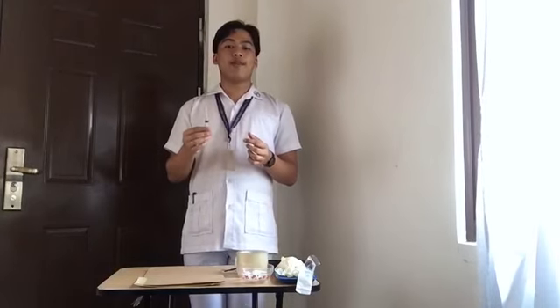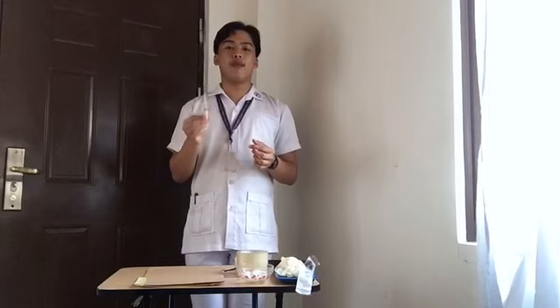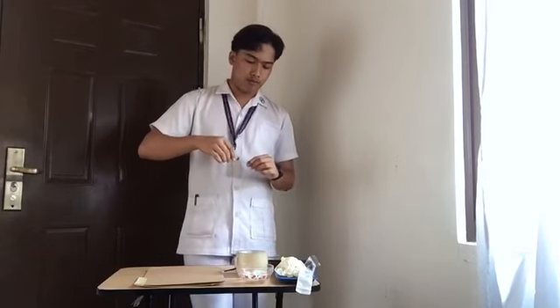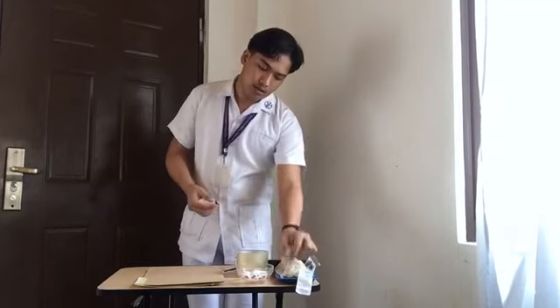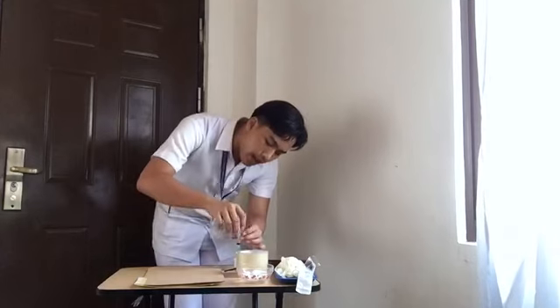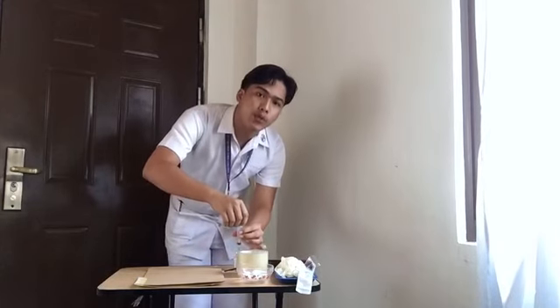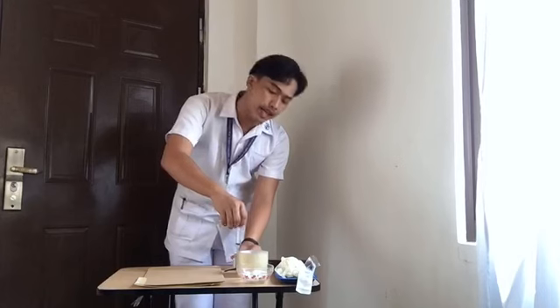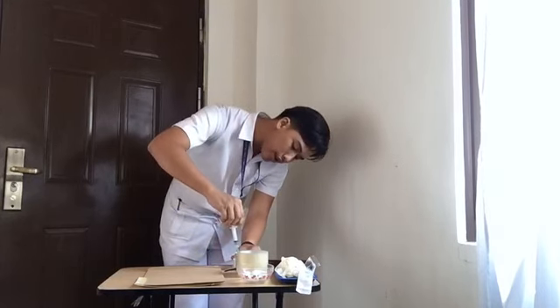Next is remove the cap of the filter needle and insert the needle into the center of the ampule. Do not touch the rim of the ampule with the needle tip or shaft to avoid injury. So I am going to put it in the center and, with a single dose amount, hold the ampule slightly on its side if necessary to obtain the ordered amount of the medication.